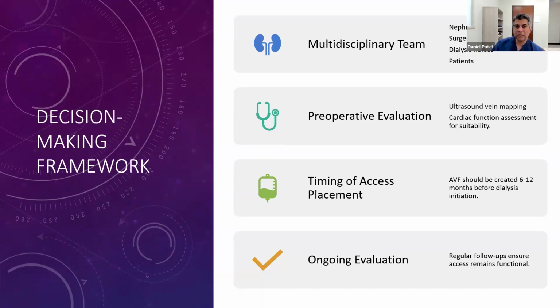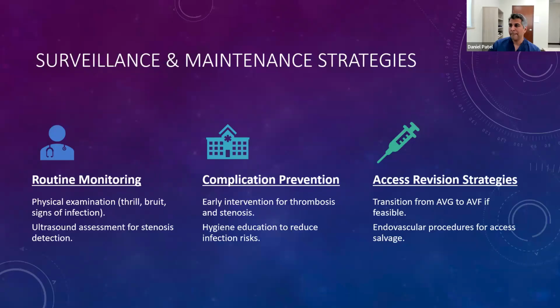And then ongoing evaluation. Once it's in, how do you follow it up? Does your dialysis unit monitor it? Do they get ultrasound follow up with their interventionalist or their specialist? Every setting is different on how they follow up an access, but it all should start at the dialysis unit. They're the ones that are seeing the patients every other day. And then surveillance and maintenance strategies, again, it's variable. We want routine monitoring by the staff, monitoring by the patient, physical exam, your pressures, your clearances, and so forth. We utilize ultrasound in my setting to follow them up. We want to intervene when we can, avoid complications, hygiene, and so forth, all the basics.